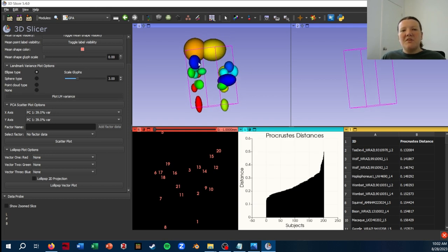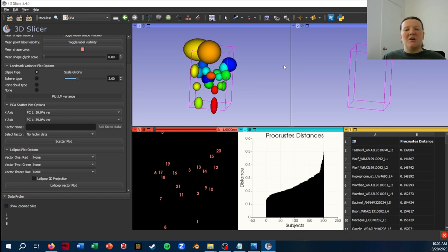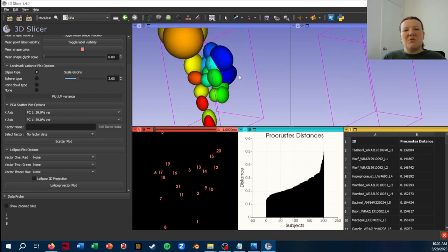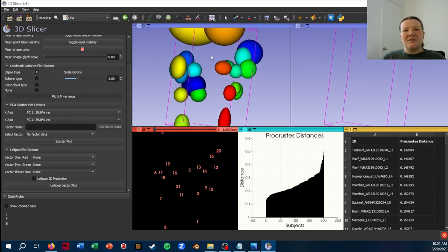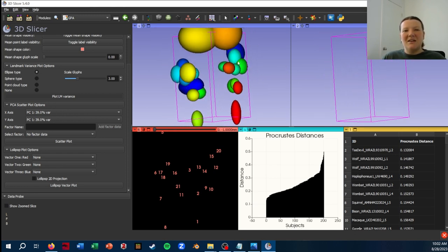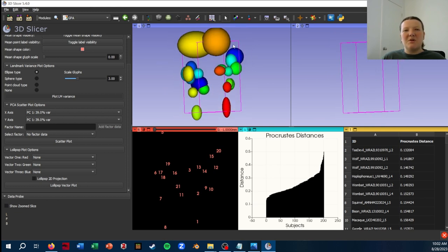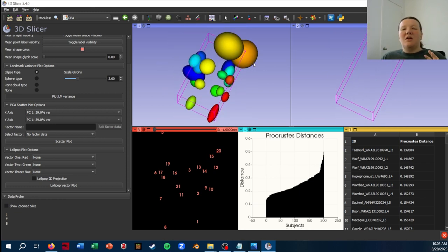And what this is showing is how much the specific landmarks are varying. So in my vertebrae case, it's hard to tell what these are, but these two that are varying a lot are the tip of the neural spine.